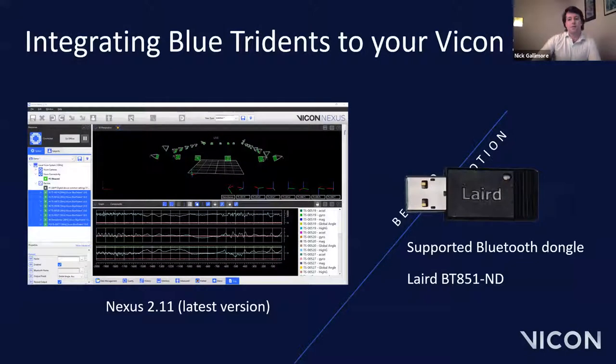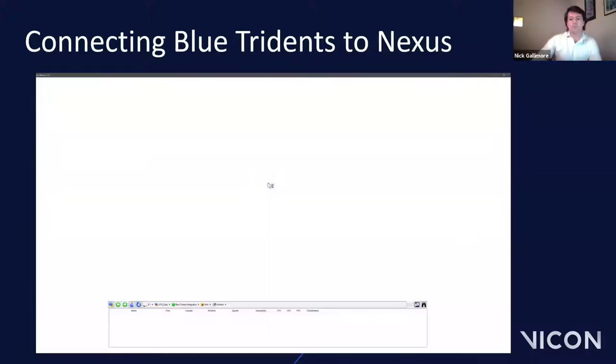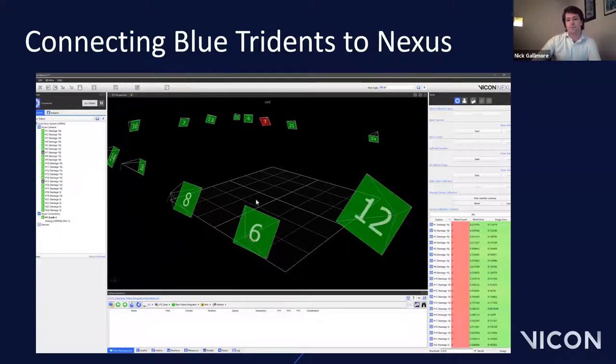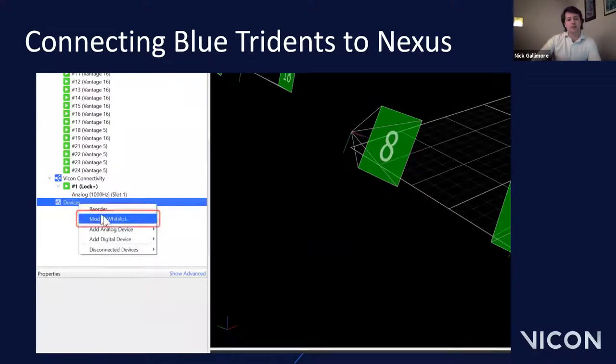That brings us to Section 2 — the Blue Trident Nexus integration. In this section I'll take you through how we connect the sensors to our motion capture systems, how we calibrate sensors to use the global angle outputs, transferring data from the sensors to the PC, and how we view and export IMU data. Before you start, make sure you're running the latest version of Nexus available — currently 2.11. Since the sensors connect over Bluetooth, you'll also need a supported Bluetooth dongle plugged into the capture PC.